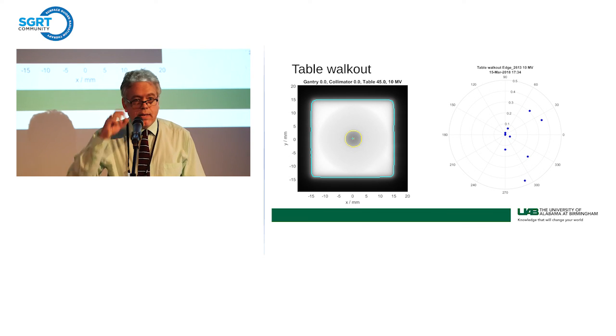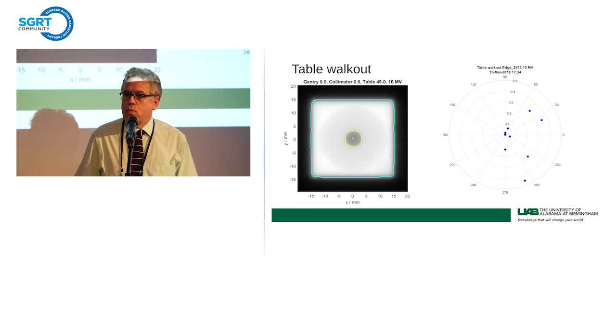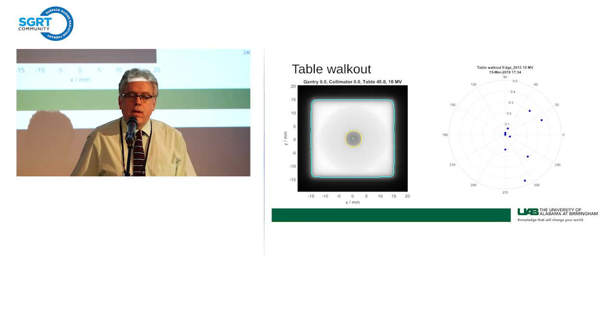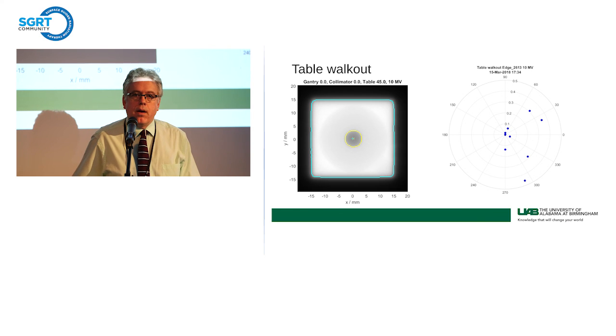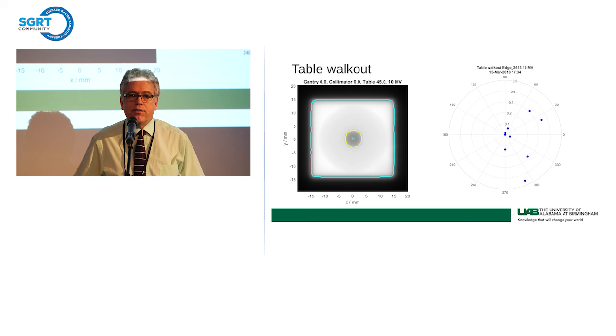So our conclusion is really that OSMS, with the ACO and the new recommended calibration procedure, is really giving you information to sub-half millimeter accuracy. But its uncertainty is still on the order of the couch walkout, so you probably can't really use it to correct for couch walkout during treatment. We think it's a great system, but we also think you'd probably have to push it to probably sub-10th millimetric accuracy before it would begin to supersede cone beam as your final gold standard during treatment.